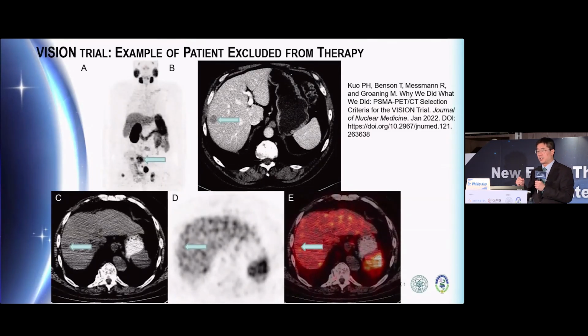Nuclear medicine physicians, I was one before I did radiology. I believe you can do this. You're not looking for tiny metastases, okay? Dave and I are radiologists too. I guarantee you, we miss tiny metastases all the time. We don't like to admit it, but we do, all right?